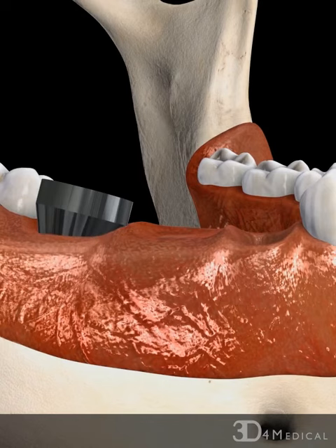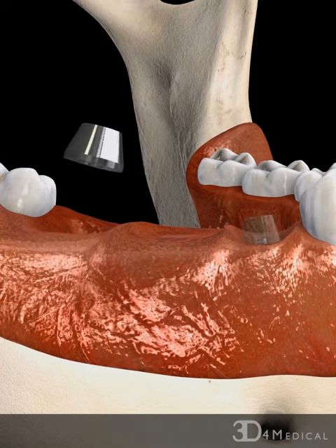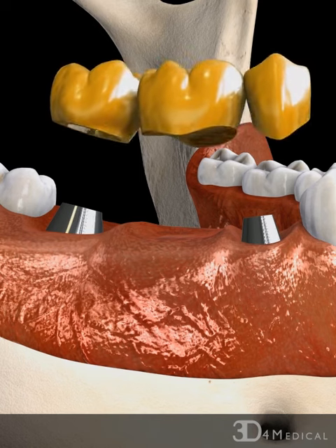Once the implant has integrated with the jawbone, the healing screw is removed and an abutment is secured on top of the implant with a screw. A second implant is inserted using the same procedure.